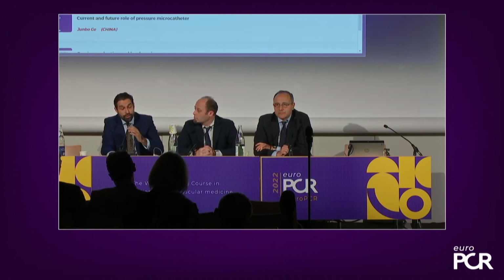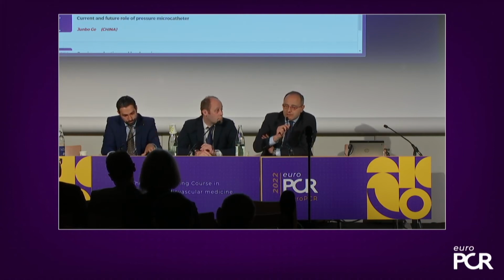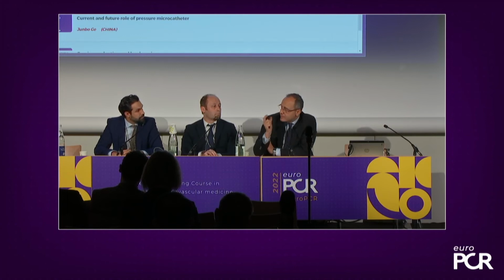So now we have learned quite a lot. That is a particular phenomenon related to the right coronary artery, that hyperemia is required to unmask these residual focal pressure gradients. Hold on, Carlos, because I'd still like to hear your thoughts on the PPG. We heard in the video that we had a PPG above 0.5, it was 0.8, and we discussed focal disease, but since you validated this index, why don't you tell us what it means, PPG?